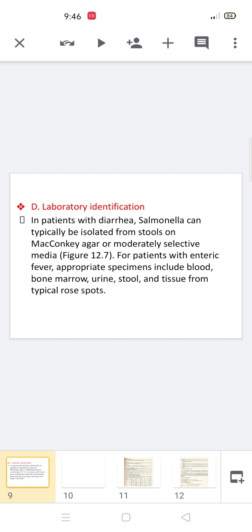In this test, we have known antibodies in the form of a commercially prepared kit, and we identify the unknown antigen from the patient serum. Known sera and unknown culture are mixed on a slide and observed under the microscope for clumping, an agglutination test. If it shows clumping, we say the test is positive. The name of this test is the rapid slide agglutination test.